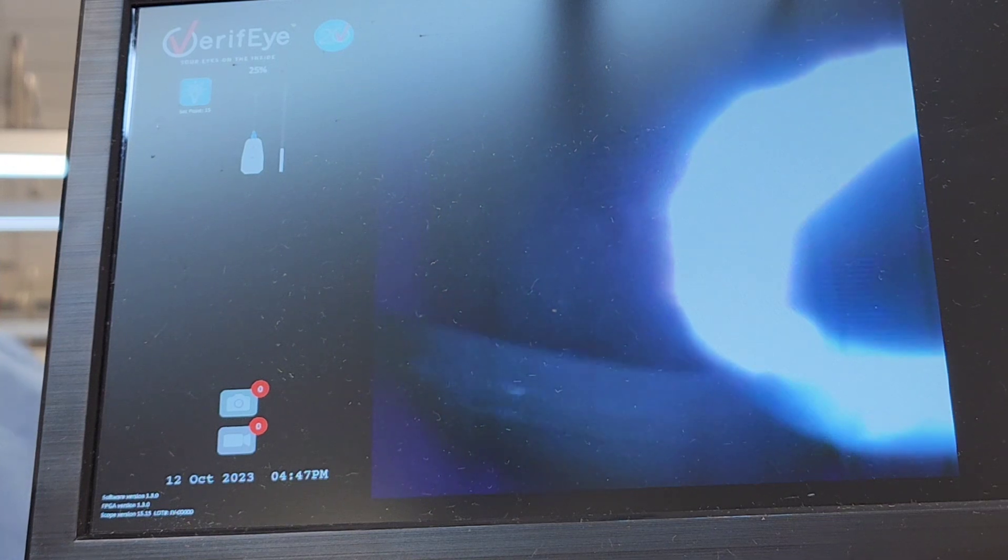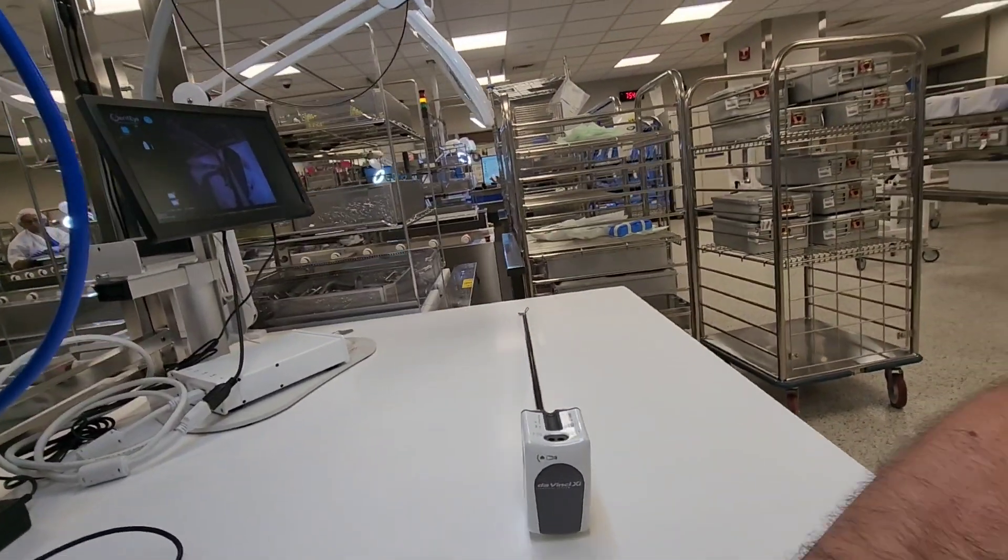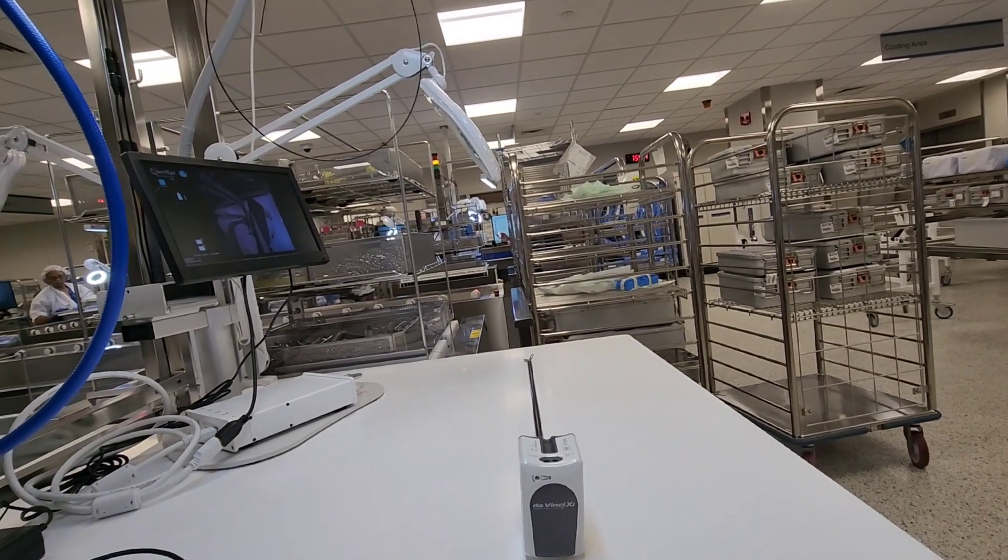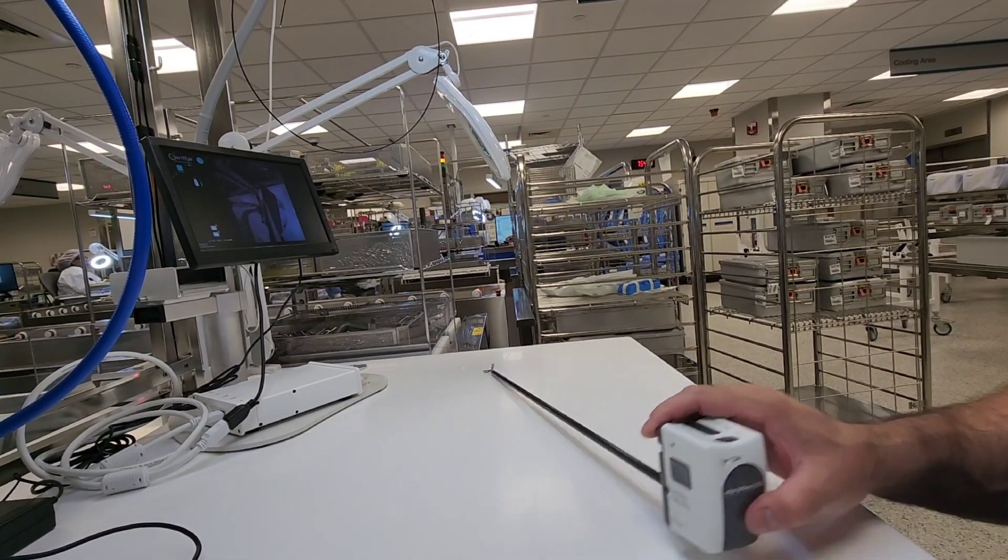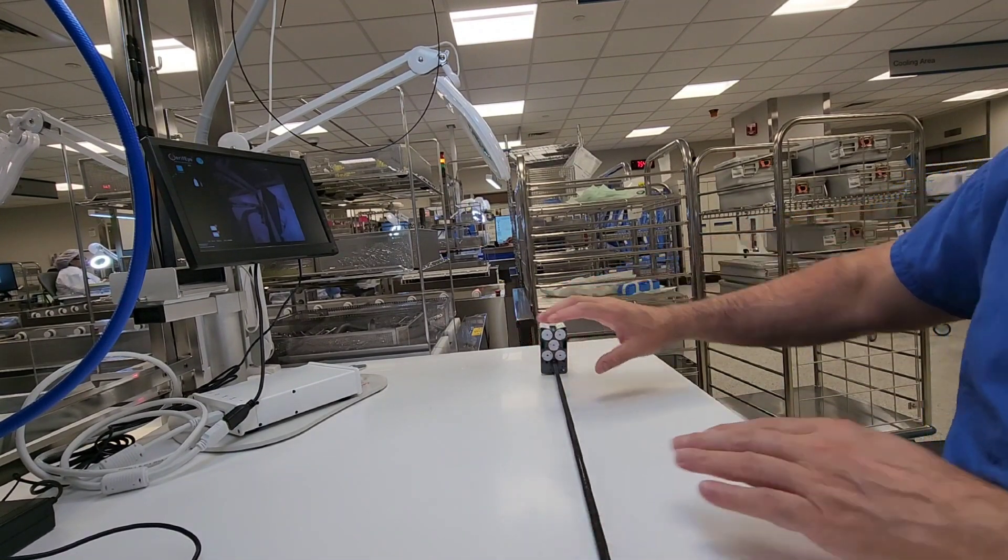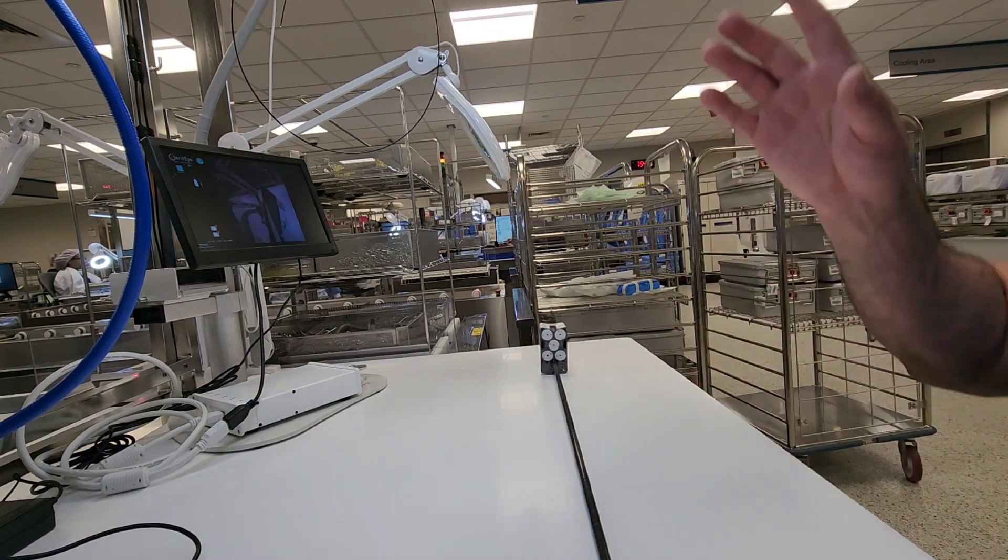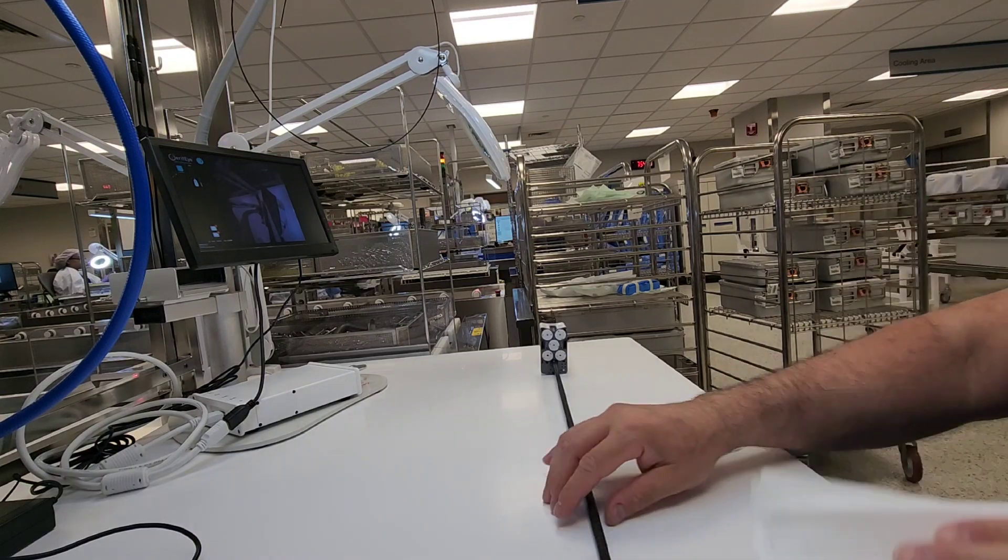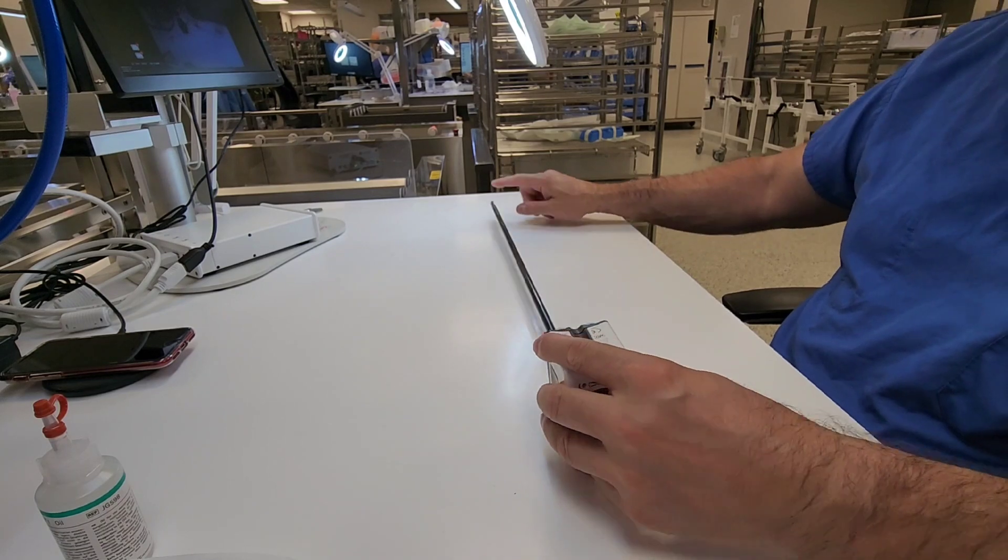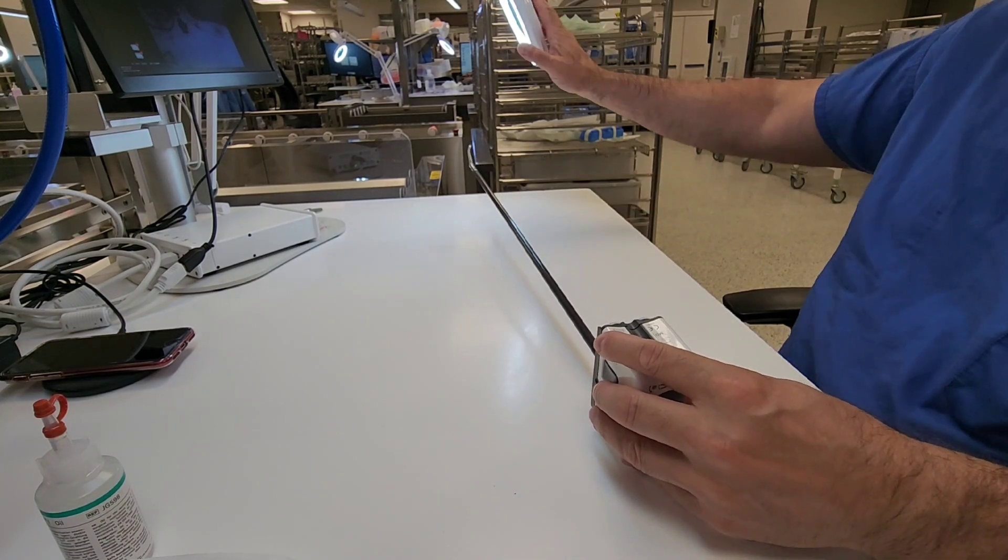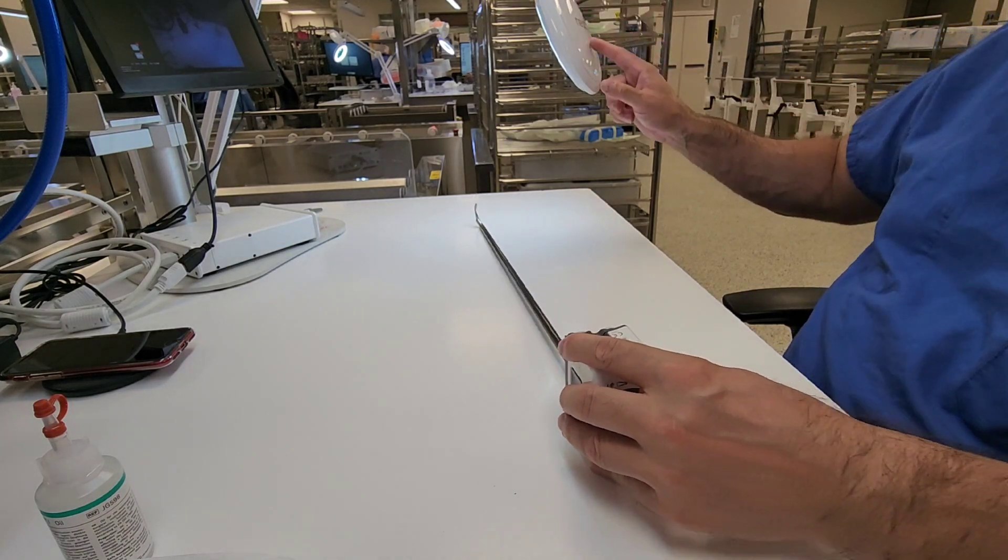I've already inspected my device here externally and internally, so next I want to inspect the distal tip with my lighted magnification. When we inspect this distal tip, we want to use lighted magnification, and according to the IFU you need four times magnification.